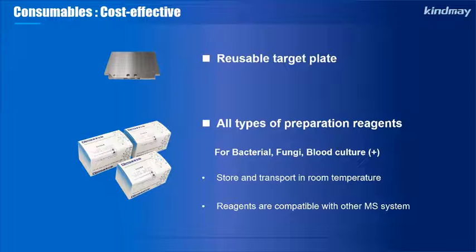You are compatible with bioMérieux, right? Yes, bioMérieux we take. And the interpretation too, with their software? The software comes from themselves, but now we are talking about the reagent. I know, and the interpretation for their software is compatible with your strain database, right? No. The software and the database are different things, because for different manufacturers, the software and database are closed.